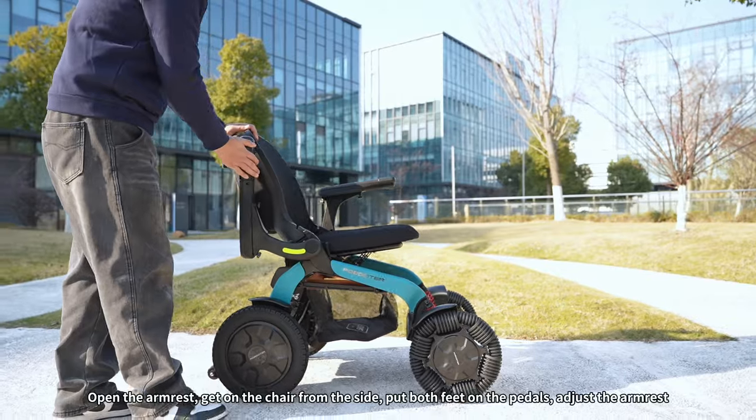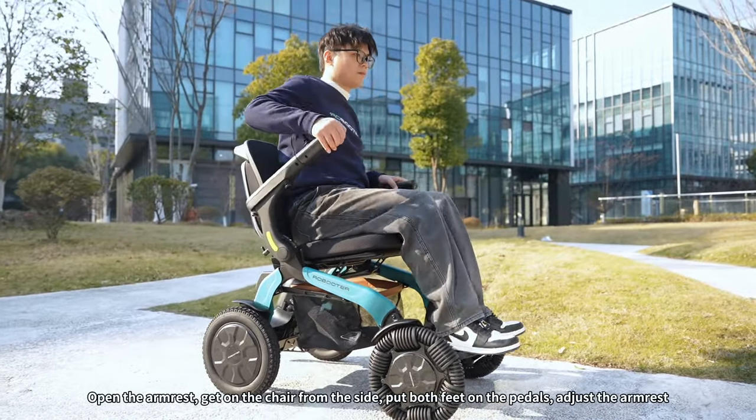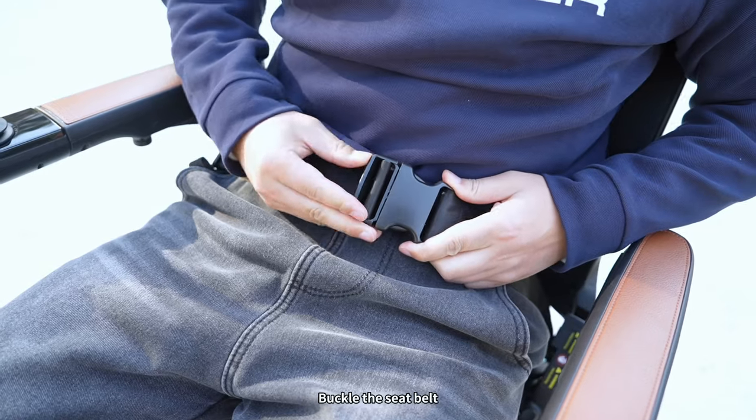Open the armrest and get on the chair from the side. Put both feet on the pedals. Adjust the armrest and the length of the seat belt, then buckle the seat belt.